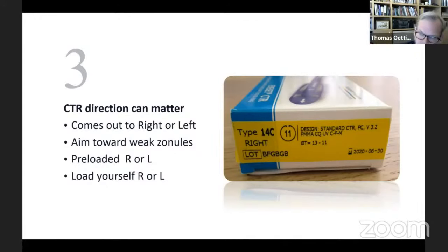Now, sometimes you load it yourself. And if you load it yourself, you want to load it in a way so that it comes out in a way that is of best value to your surgery. So keep that in mind, that there's two directions and that you're in charge of how that works.